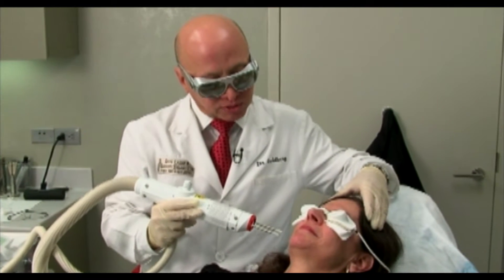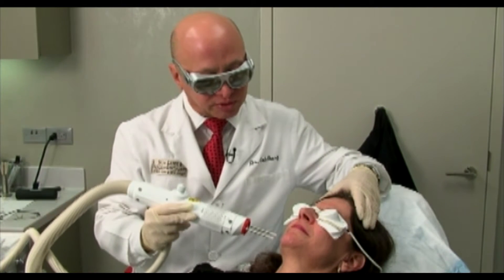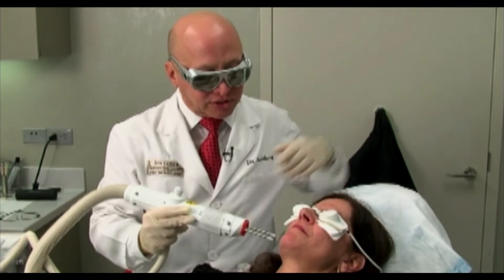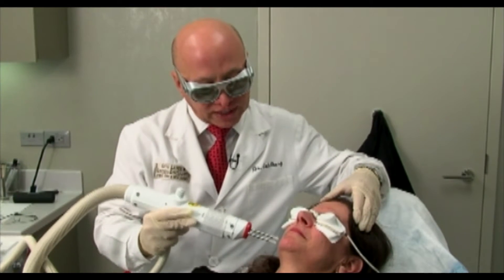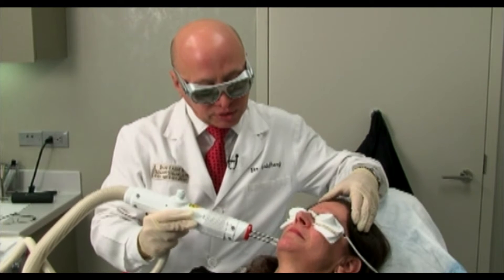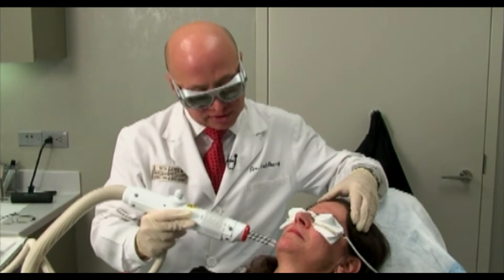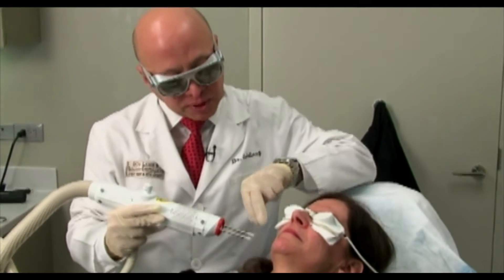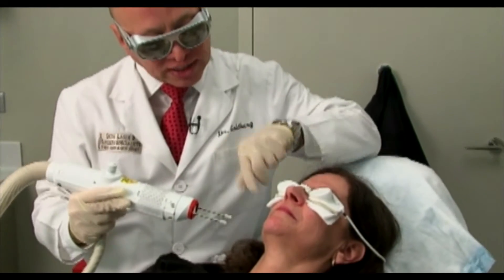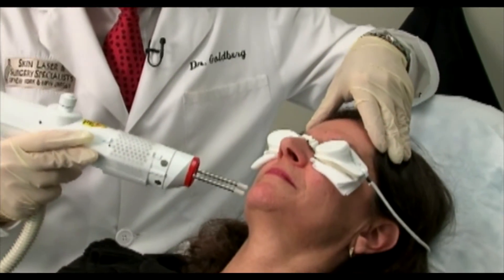We're coming over these areas with a two-millimeter lens, giving us a much higher fluence at 191 joules per centimeter squared. There's a spacer here, and what we want to do with the spacer is essentially hover over the area that we're treating — not touching the skin, not being far away, but being almost on top of it. This is much higher fluence, but immediately there's a little coagulation there. That vessel has been annihilated, which is really what we want.